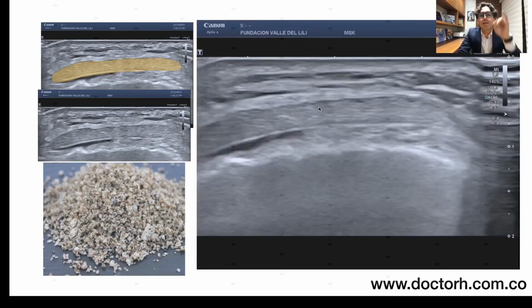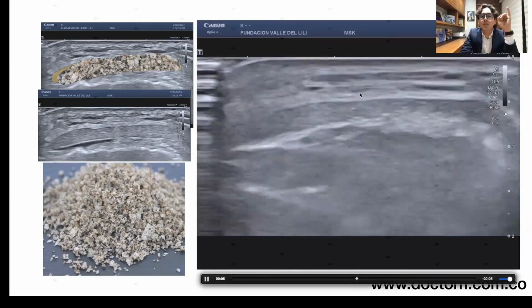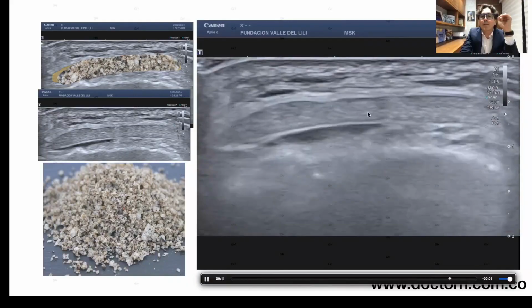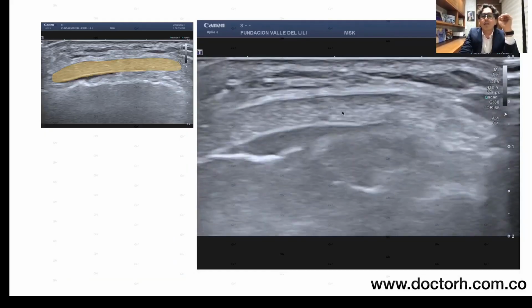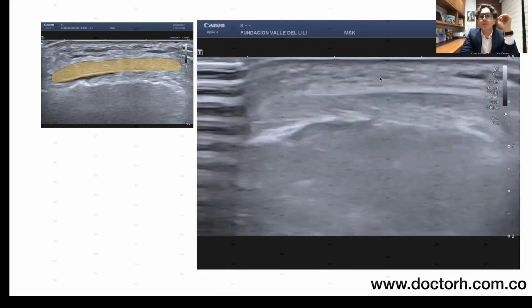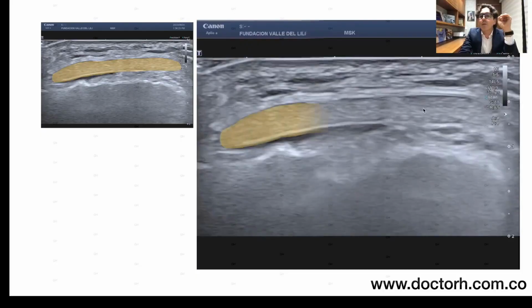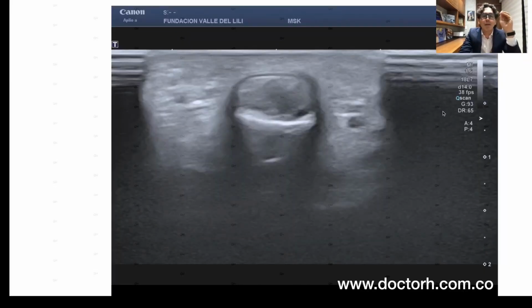So the first concept for identification, a tendon in the transverse view: let's look for a salt and pepper, which is this well-organized pattern of fibrous hyperechoic image with very, very fine anechoic areas. Salt and pepper image, tendons in transverse view. Let's identify alternating anechoic and hyperechoic images with a small fibrillar appearance.